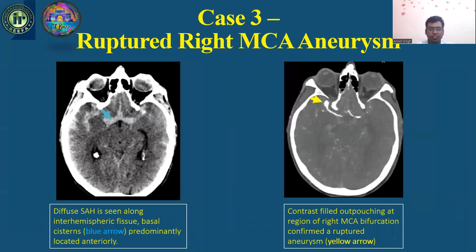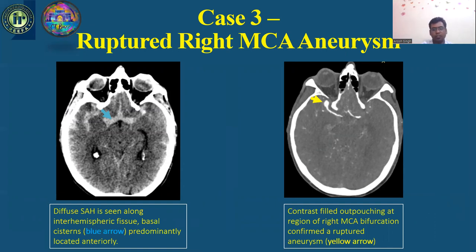Case 3: On NCCT head, we can see a ruptured right MCA aneurysm with diffuse SAH along the interhemispheric and basal cisterns shown by blue arrow, predominantly located anteriorly. On CT angiography, we can see a contrast-filled outpouching at the region of the right MCA bifurcation confirming a ruptured aneurysm, shown by yellow arrow.